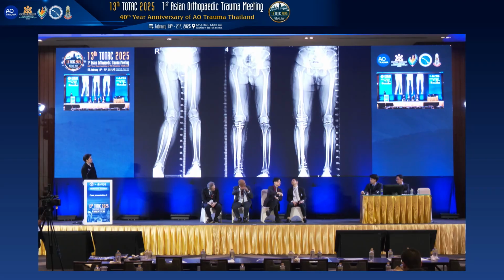If it is very distal, yes, then we do a medial closing wedge with a plate, with a TomoFix or whatever. But here the CORA was much higher. That's why I asked him where the CORA was. Because if the CORA is higher, then a nail is definitely a better implant.